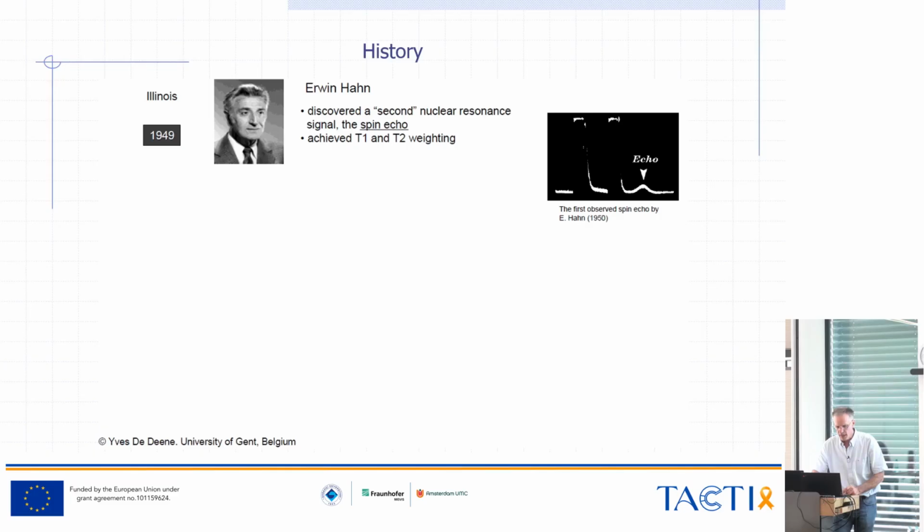He applied the RF pulse, so that's a really high intensity, and the oscilloscope will just cap this signal because it's so high. And then he sees this very rapid decay. Then he applied the next excitation pulse and also saw this very rapid decay. But then he saw some signal reforming again. Back then, that was a little bit magic to him. He didn't know at first where that was coming from, but then he realized what was going on.